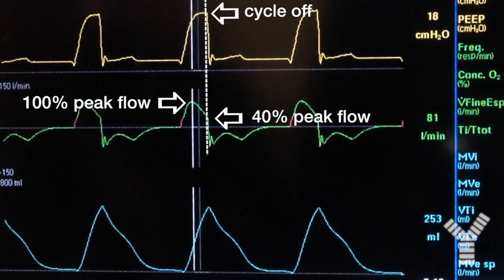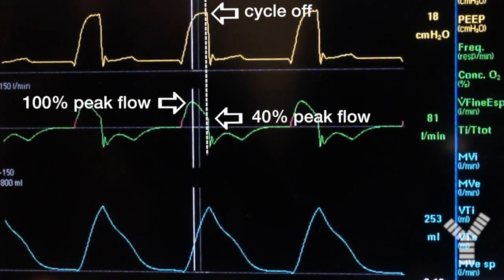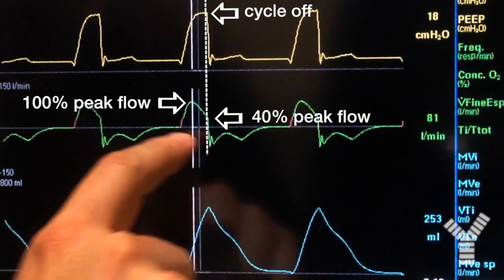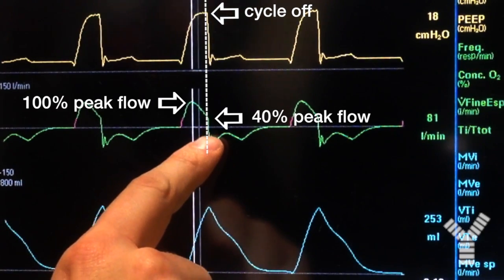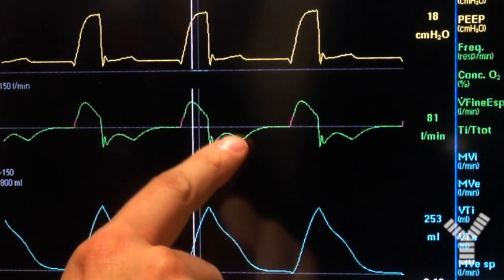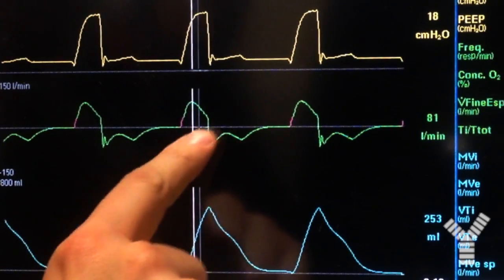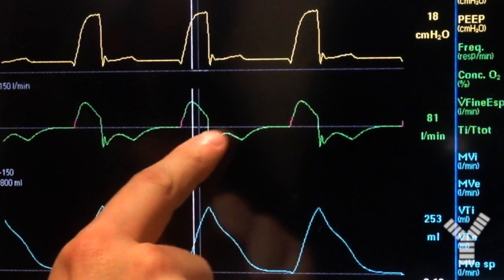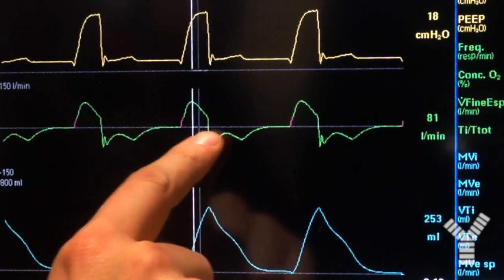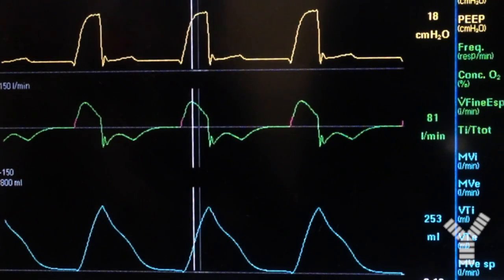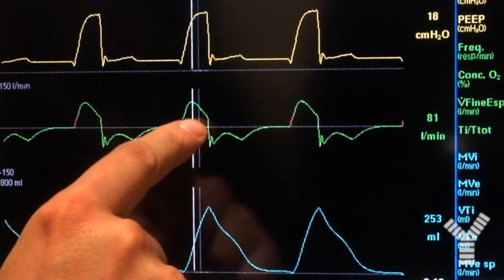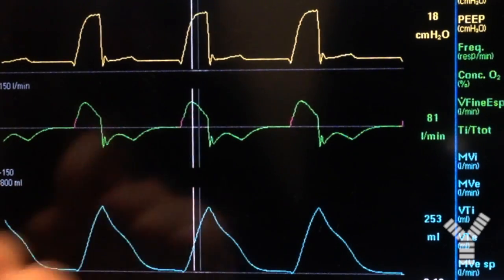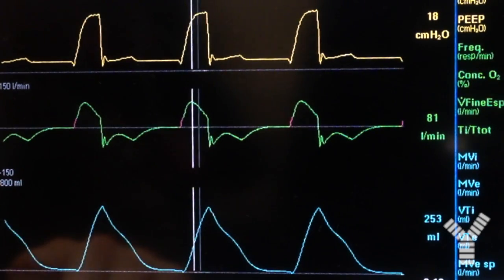In this case, cycling occurs too early, as we see from the shape of the expiratory flow that indicates the presence of residual inspiratory effort from the patient during his transition to expiration.